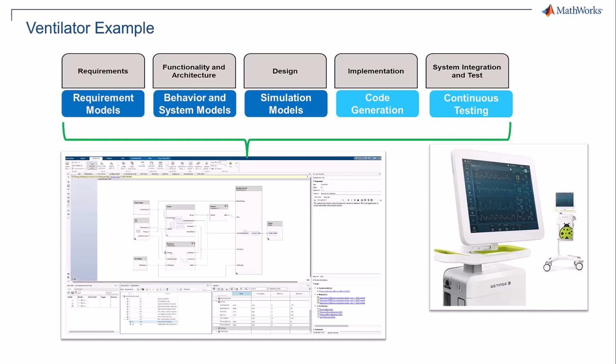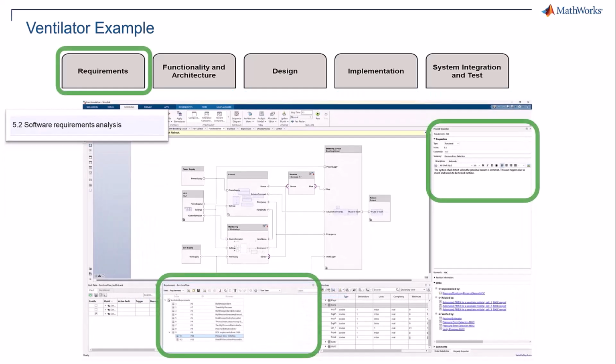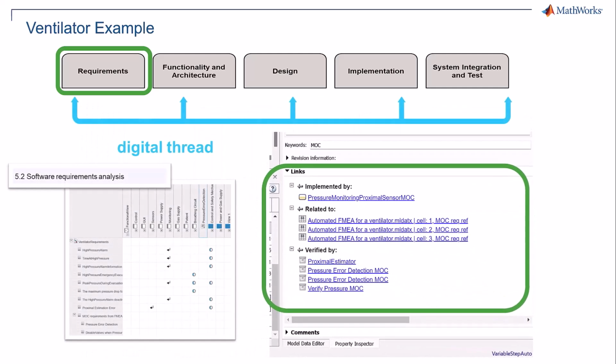As I mentioned earlier, the software development within this example maps to the standard IEC 62304. In Certification Toolkit, all process steps and tools are described, but I will now go through the key elements of this process, starting with the requirements. Using a canvas-focused workflow, all your requirements will be shown next to your model using Simulink Requirements. Let's take a look at the links at the bottom right corner. You can see links between requirements, test cases, and test results, and also with your FMEA within easy reach. These digital threads are easily handled, and artifacts such as traceability matrices can be easily exported.